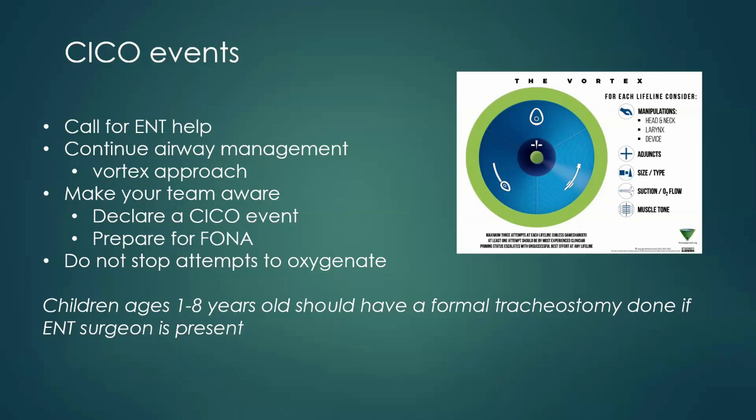But once again, if you are dealing with the airway, then continue with the airway management, but get as many hands as you can for this. You're going to continue your airway management. That doesn't stop. And with that being said as well, you do not stop any attempts to oxygenate. That needs to continue regardless of what's happening.